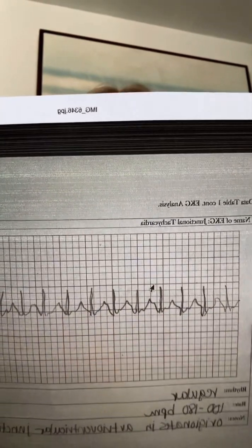Next we have junctional tachycardia. This one is regular, 100 to 180 beats per minute, and originates in the atrioventricular junction.